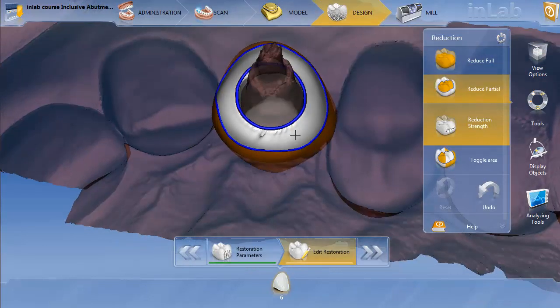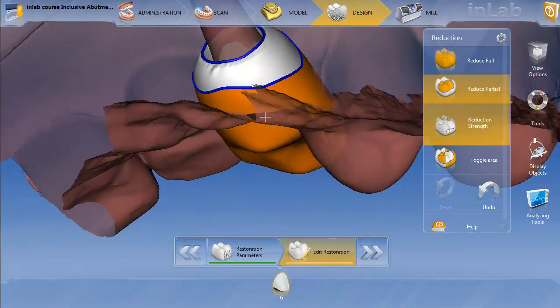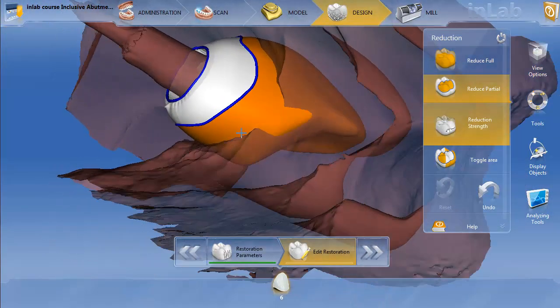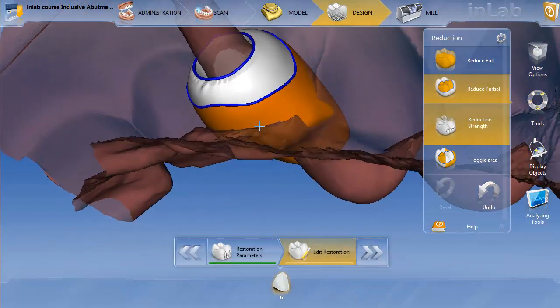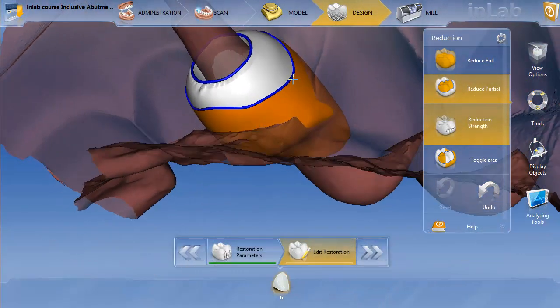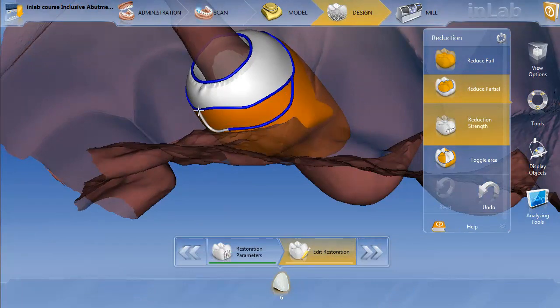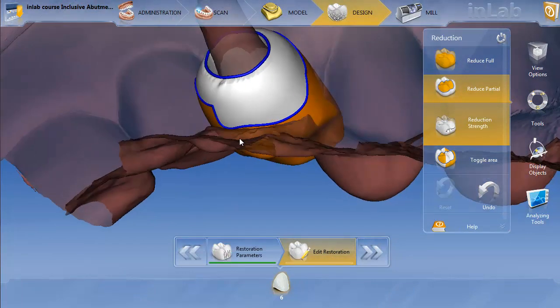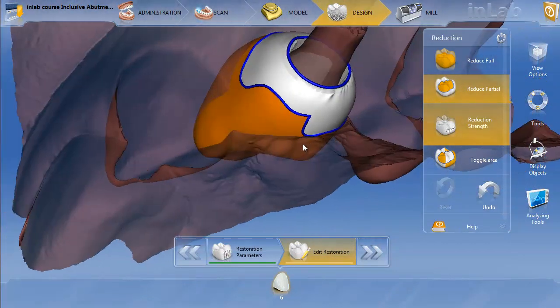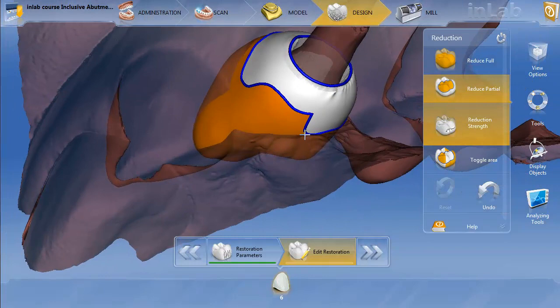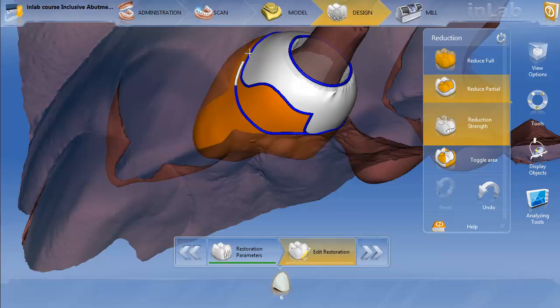So you can see everything that's going to be reduced is going to be orange. I just drew that to give myself a start. We're going to go back and redraw the line. Since we're doing Emax, it's going to actually blend in pretty nicely to the restoration.